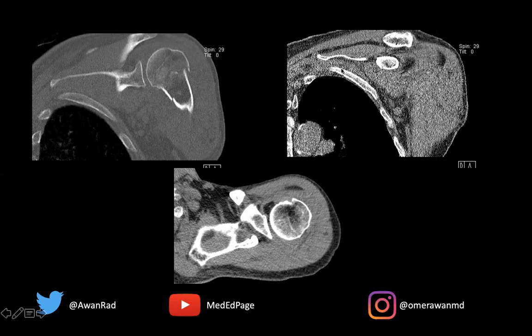In the coronal plane, notice that there's fat in the joint. So there's probably a lipohemarthrosis suggesting an intraarticular fracture, because fat and fluid within a joint space is a marker for an intraarticular fracture. Where does the fat and hemorrhage come from? From the bone — because the bone is made up of fatty marrow or yellow marrow, and red marrow or blood.